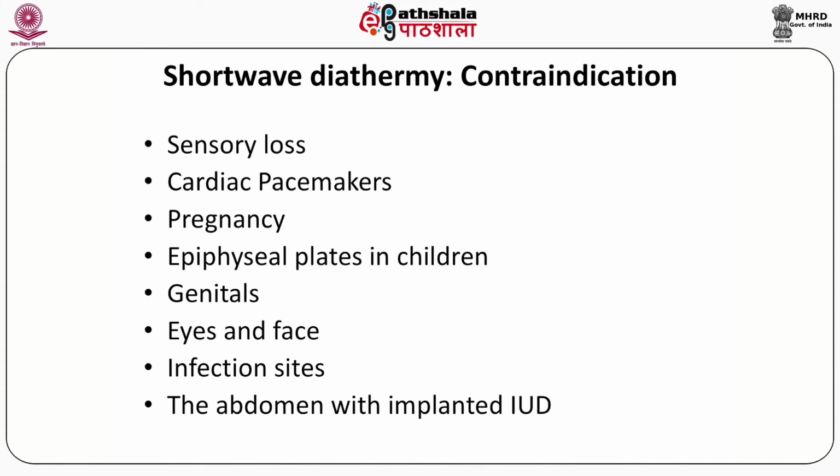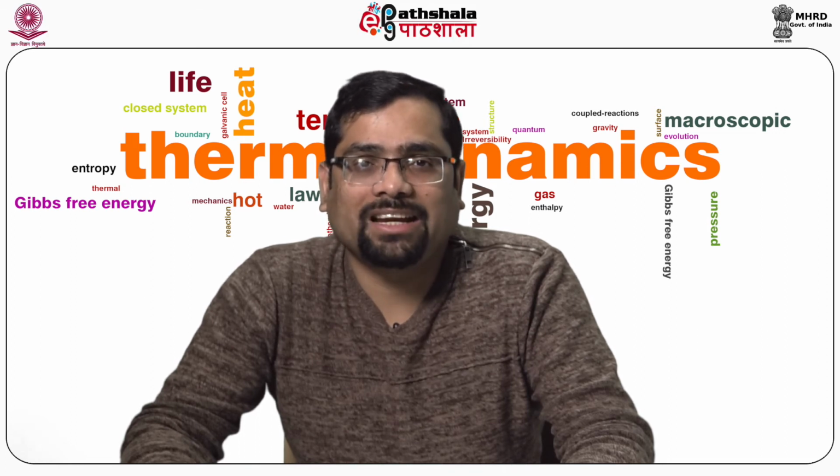In pregnant ladies, we should not use the shortwave diathermy. The shortwave diathermy should not be used at the epiphyseal plates, particularly in children, as it is the growing end of the bone. It may harm the growth of the bone. Also, the shortwave diathermy should not be used in the area of genitals. Also, it should not be used at the eyes and face.